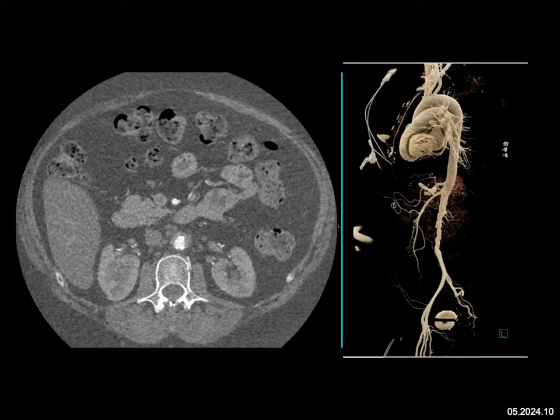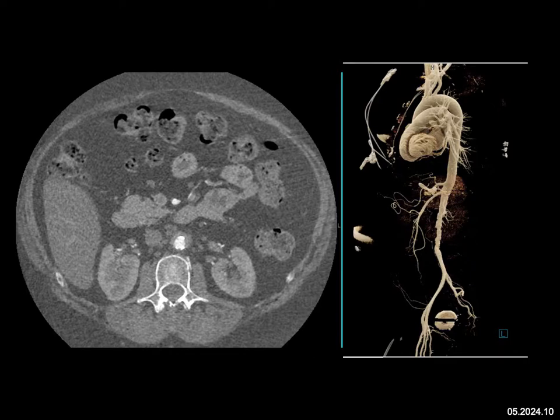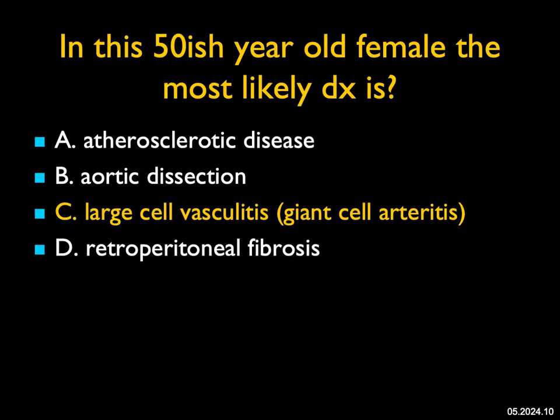But more in this case, it's thickening of the wall of the aorta, which explains the narrowed lumen, and it doesn't have the extent you would expect with retroperitoneal fibrosis. Large vessel vasculitis is something to consider, and in fact this was a case of giant cell arteritis. Could it be Takayasu's? Could it be Kawasaki's? Kawasaki's is more commonly associated with coronary artery aneurysms, and Takayasu's more commonly involves the left subclavian artery. But large vessel disease and giant cell arteritis is a great choice — and that was the correct answer.